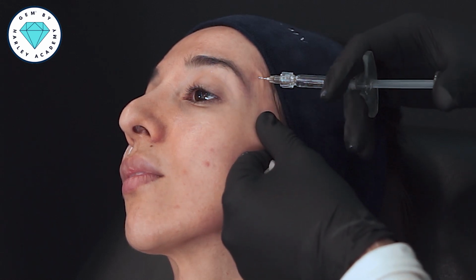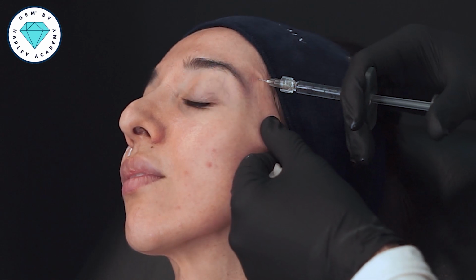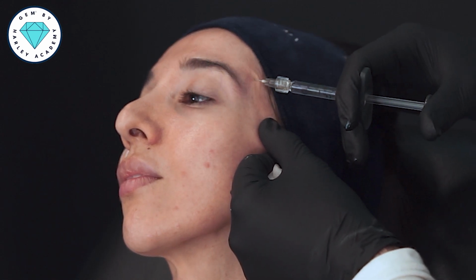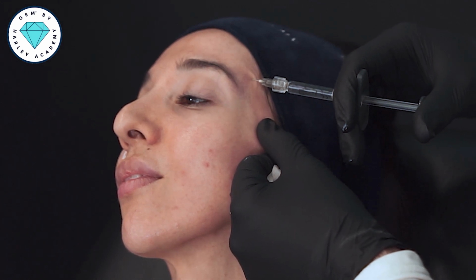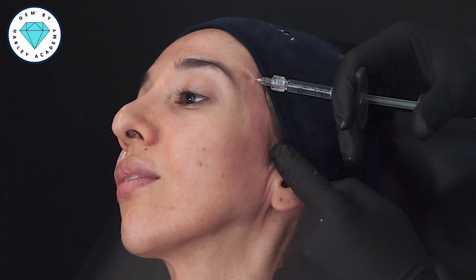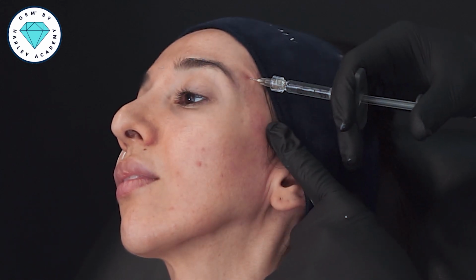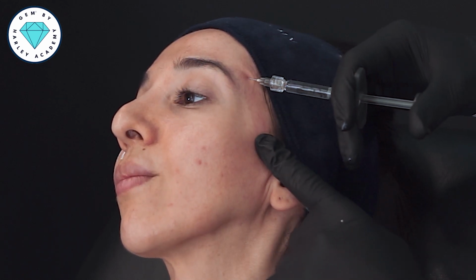So now I'm going to slowly inject, keeping this 45-degree angle and staying nicely down onto bone. Sometimes a little air bubble like that makes a little clicking noise. Can startle the patient when it's perfectly normal. All the while I'm injecting, I'm looking for skin discoloration, I'm looking for blanching, I'm looking for any pain. Comfortable? Yeah, good. So now we just continue slow injection.